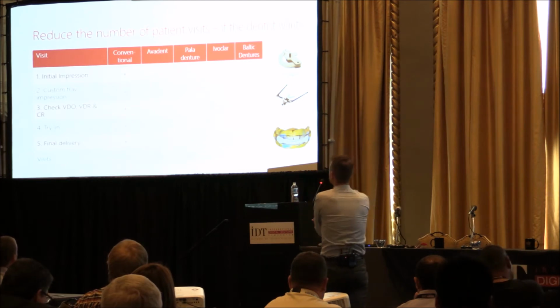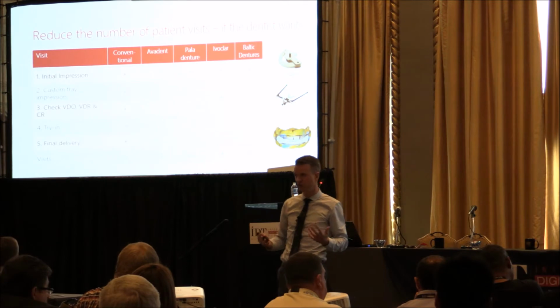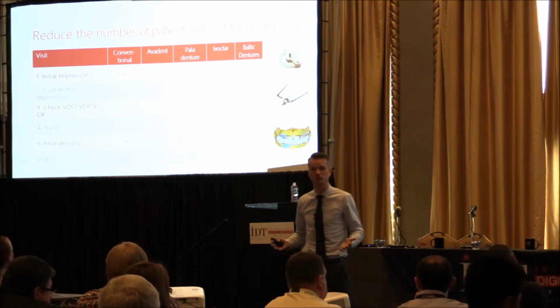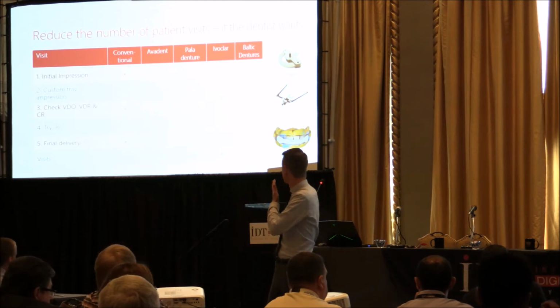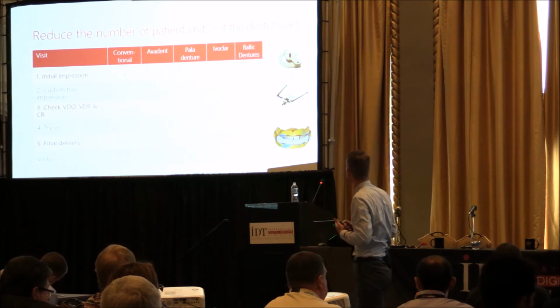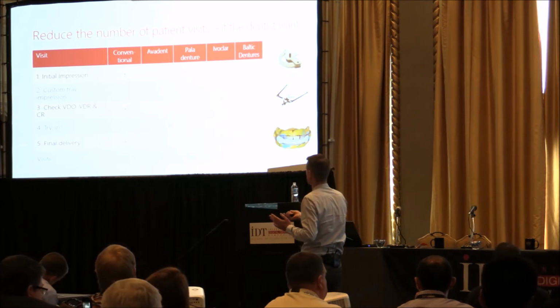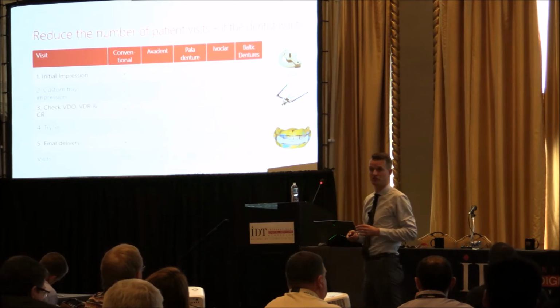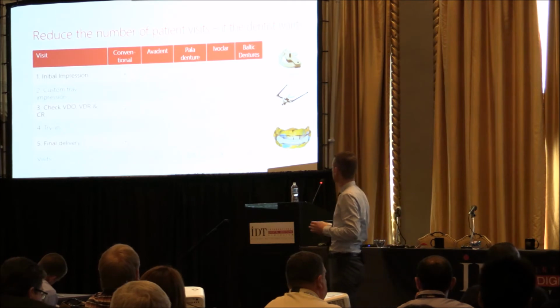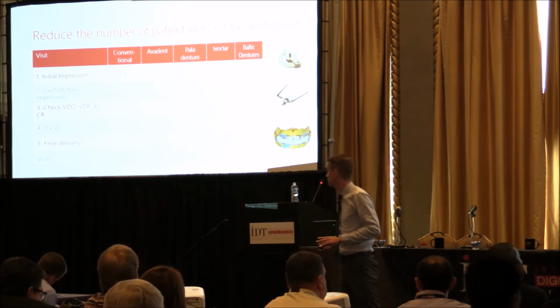All right. There is no doubt you can do it, but you don't have to do it, guys. You can work on the conventional workflow if you want. You can transition. You can take evolution and not revolution steps. But of course, there are people that are working well today. There are some systems that are better than others. There are some systems that are more revolutionary than others. Going from initial impression to final delivery, I think is very optimistic. But with 3 steps, as some people are doing in different ways, I think is feasible, and it's for sure going to be feasible going forward.